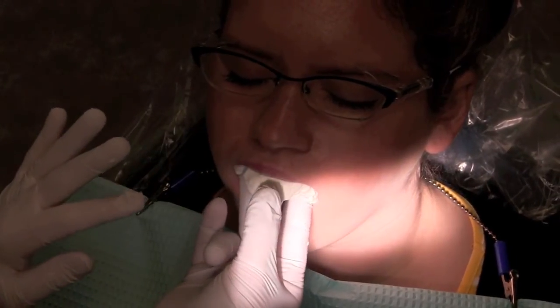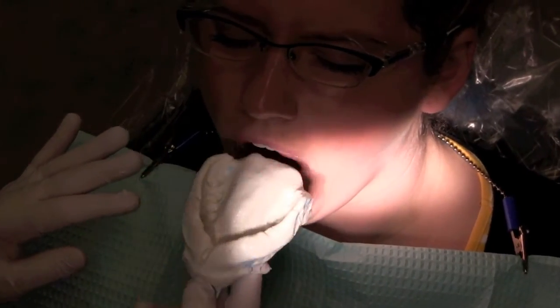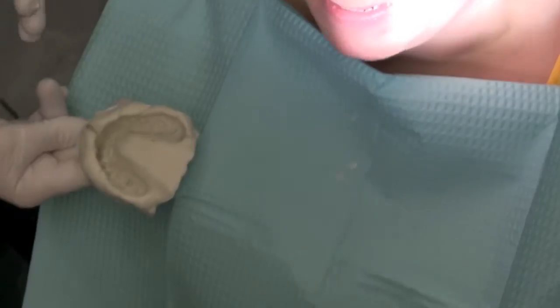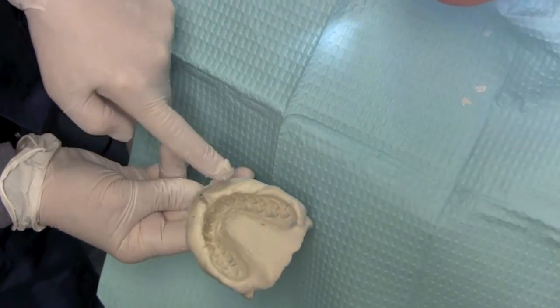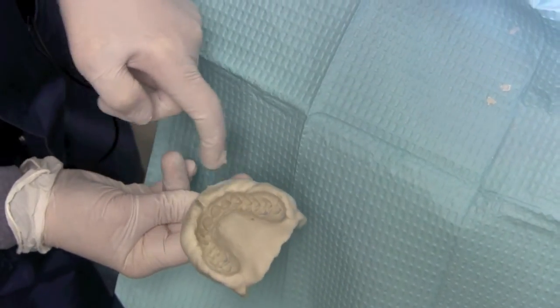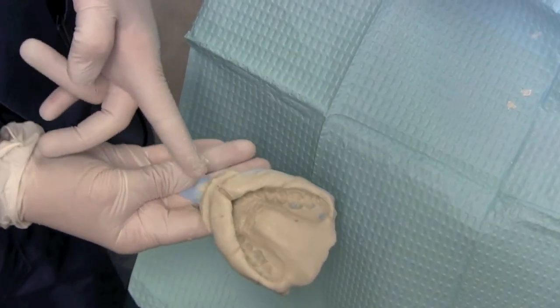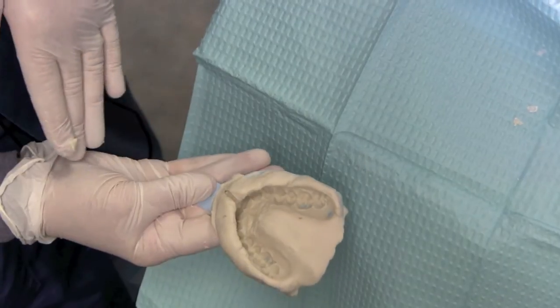I'm going to be removing the impression now. Once again, Katie, we got an excellent impression. We got the whole periphery of your lips and the outer structures and even your frenum. We got the palate, and your teeth are all present and in perfect position. We always want the tray handle to be coming out the middle of your arch.